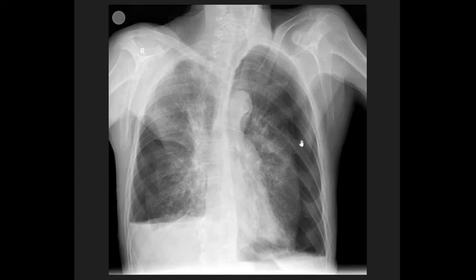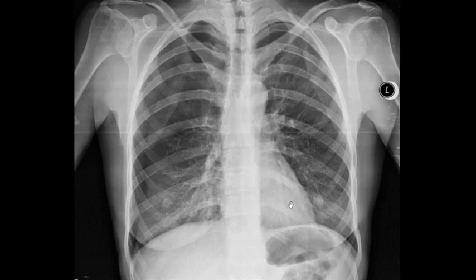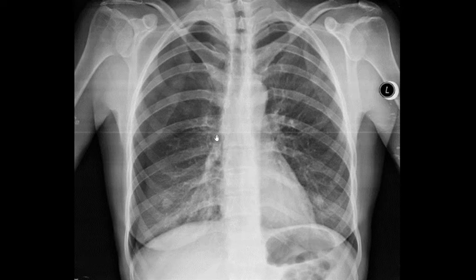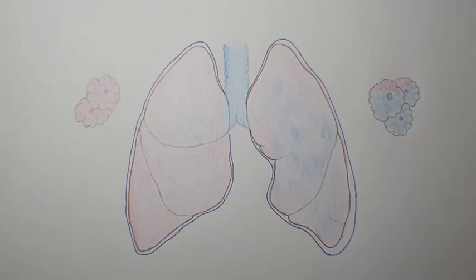In this case the hydropneumothorax is bilateral, present in both hemithoraxes. These three X-rays show a simple easy-to-identify pneumothorax, then more complicated cases. To become proficient, the basics must be laid out, and then quantity matters — looking at more and more normal and pathological X-rays allows the eye to accommodate and identification becomes easier.